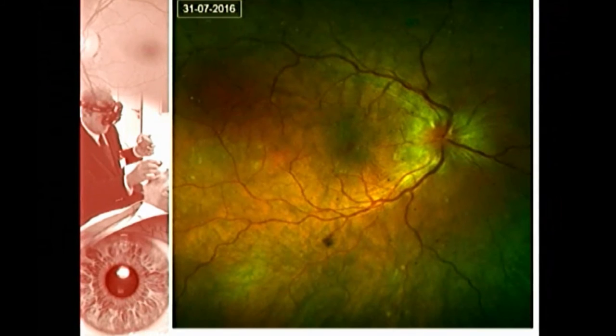So this helps us as a focal area of exudative retinal detachment, and that's one of the key points for us in the diagnosis of this case.